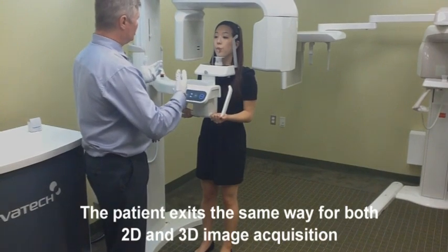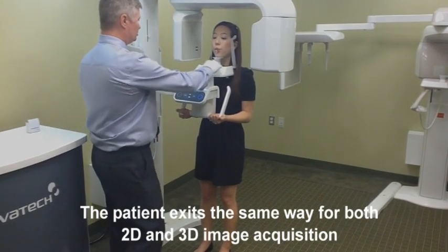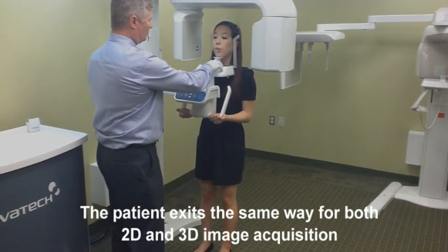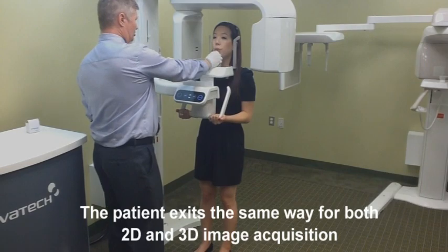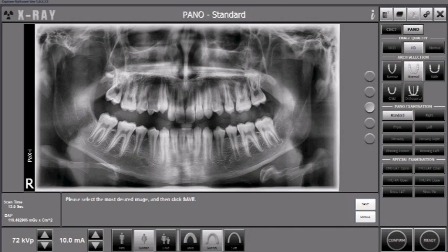So what I'm going to do is make sure that you stay in the device until it's ready to exit out. So what I'm going to do here then is rotate the temple rod knob in the front counterclockwise to open it up here for me. I'll pull it up a little bit for you and go ahead and exit out of the device again. And that's it. When we are done capturing our image, we'll then release the patient from the system, navigate back to the acquisition PC to verify that we've captured our desired image.